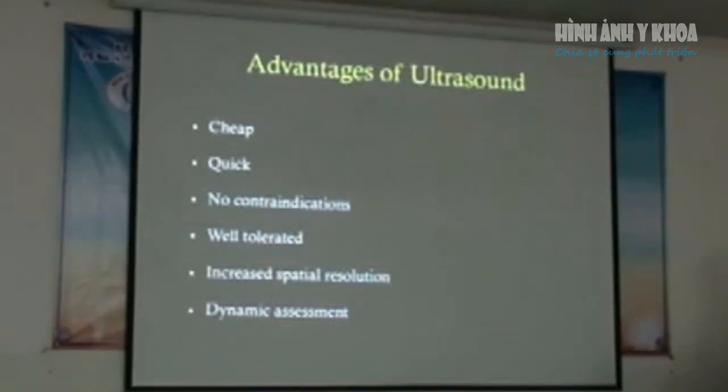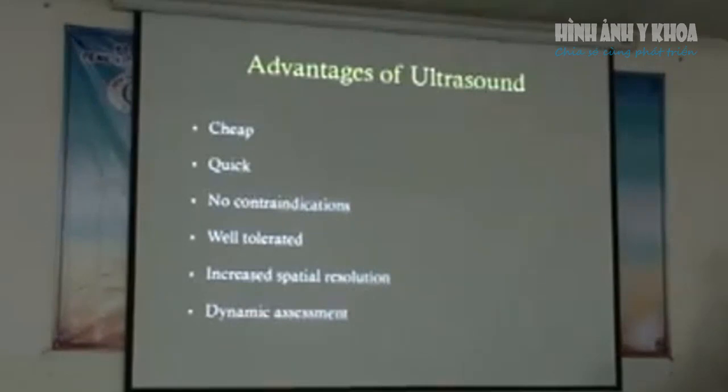So the main advantages of ultrasound is that it's quick, it's cheap, it's very well tolerated, and once again we're able to use the dynamic assessment to figure out if there's any structural changes that are hampering the dynamic function of the knee. Lợi ích của siêu âm là rẻ tiền và làm nhanh chóng, không có chống chỉ định, độ phân giải cao và có thể đánh giá động chức năng của vùng này.